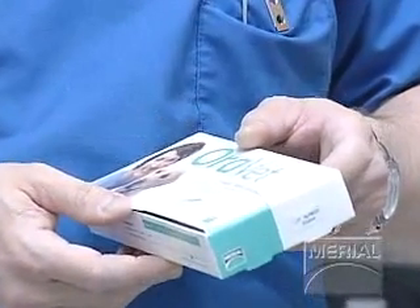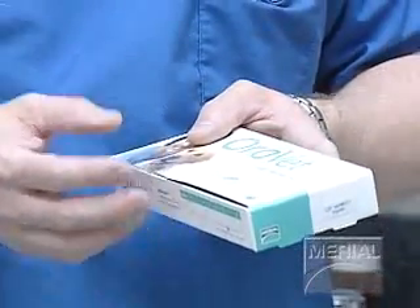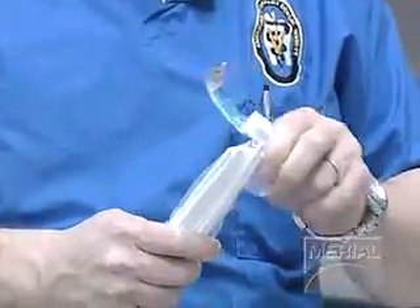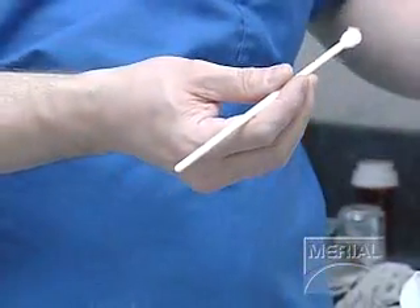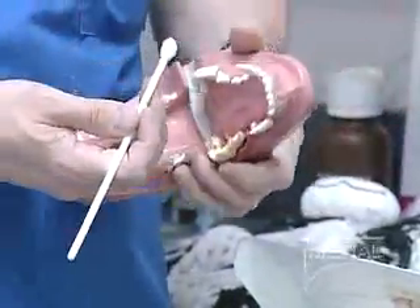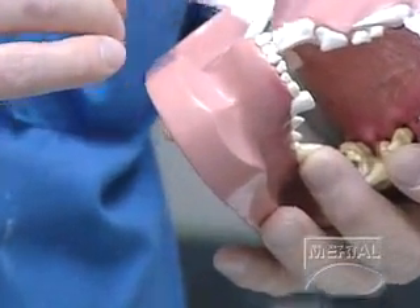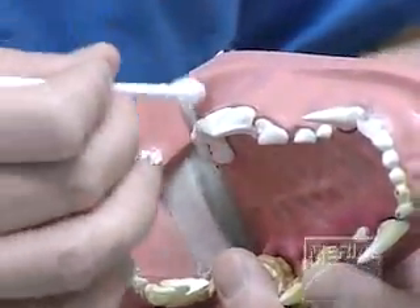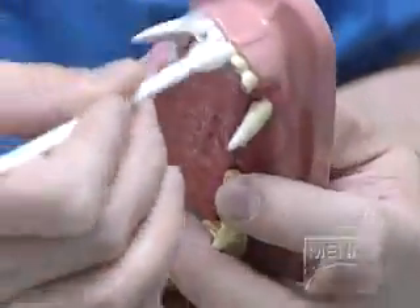OraVet is a plaque prevention product — a waxy-like material that we professionally applied during the dental cleaning today — and it prevents plaque from adhering to the surface of the teeth. Most pet owners can just use their finger to apply it, or these sponge tip applicators dabbed into the material. You rub it right along the gum line, and it will seek out the OraVet that was professionally applied and re-adhere to build up these waxy layers. Through the week these waxy layers will shed, and then you re-apply them on a weekly basis.